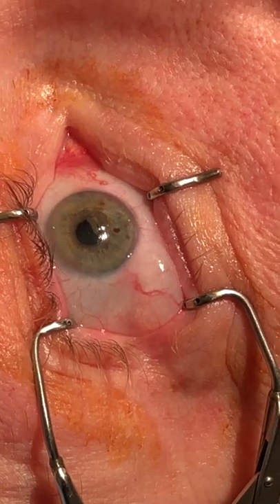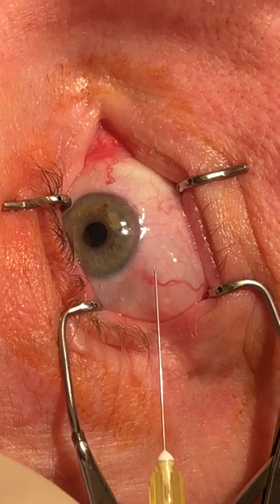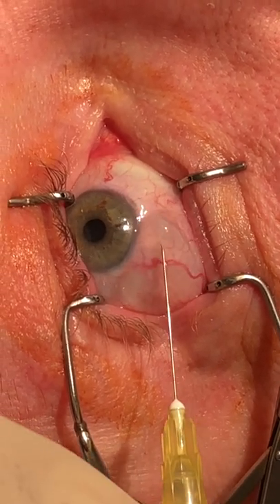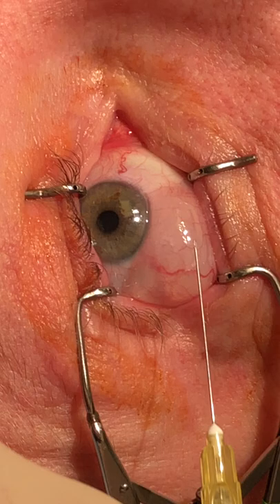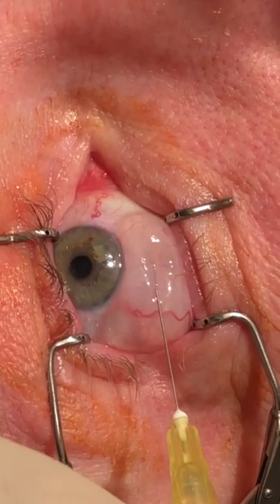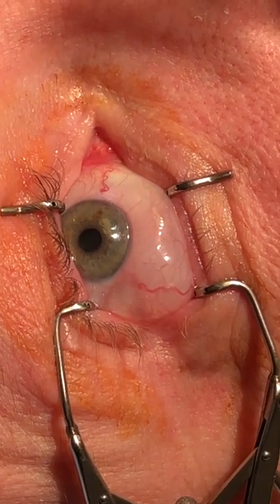This is my procedure for conjunctivochalasis. I've tried everything — patch grafts, sutures — but basically what we're doing here is giving him a little bit of numbing medicine to that conjunctiva, just blowing it up. This procedure seems to work the best and is easily tolerated by patients.